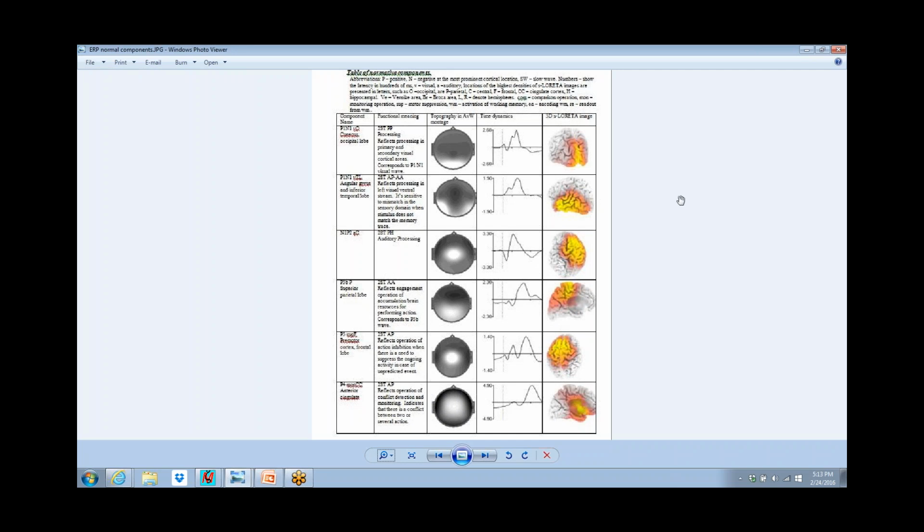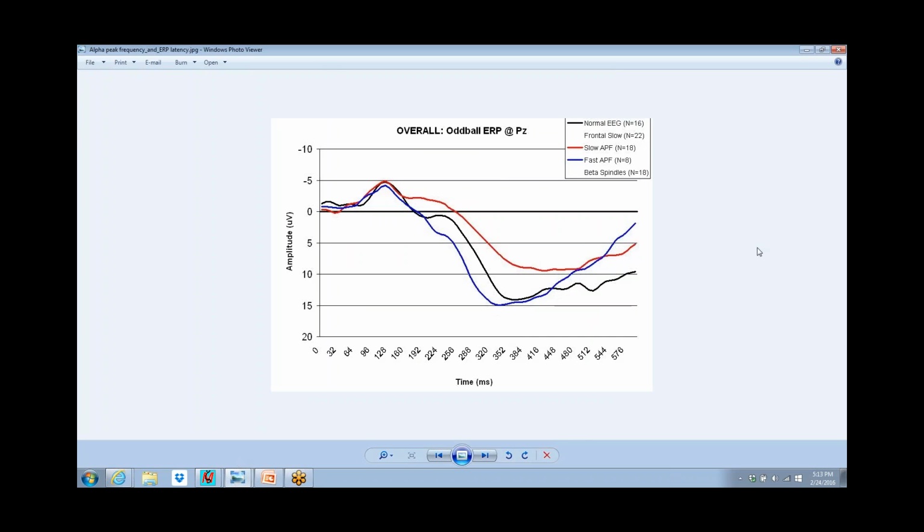So when we look at the EEG, it's full of event-related potentials of this little wavelet and this little wavelet and this little wavelet. All these little wavelets are added in as instantaneous waveforms, but they're really small. This is only a few microvolts. I mean, it's very, very small. And as such, again, the individual responses are not seen, but when you add them together, they end up adding up, not averaging out. Now, there is an interaction between the event-related potential, which here is seen as the oddball P300.